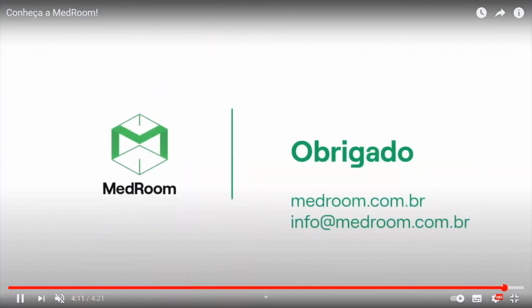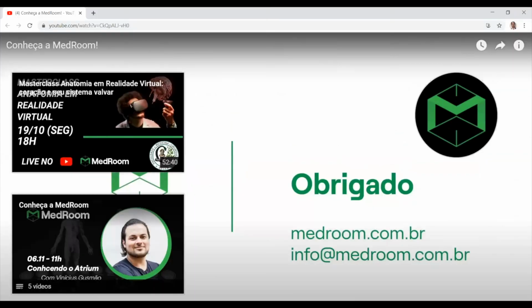So this is basically the video we want to show for the VR solution. And this VR solution is integrated in the platform. So you can have all the 3D reconstruction, all the apps, all the atlas, all the histological information, and also the VR solution we just showed. And that's what we wanted to show you guys. I think this last one was even new for Sherbel and his team. So if you have questions, we are open to answer.